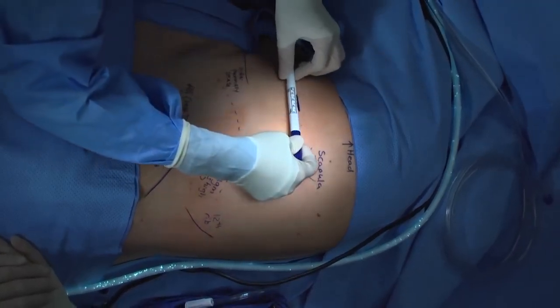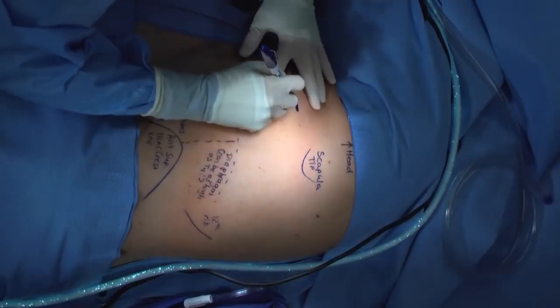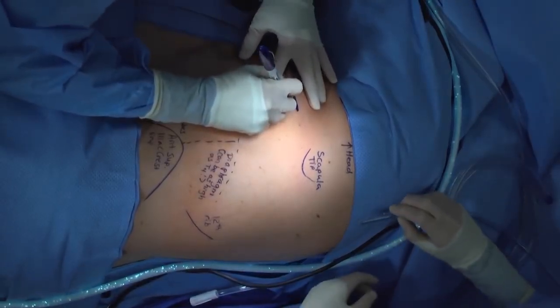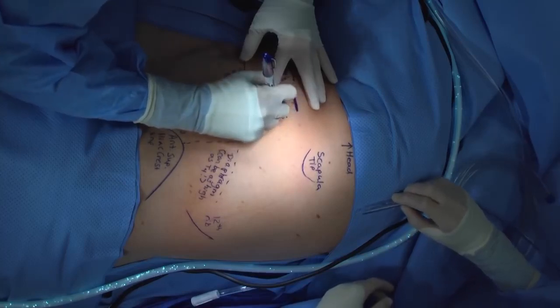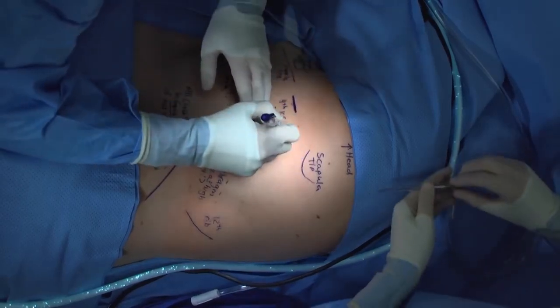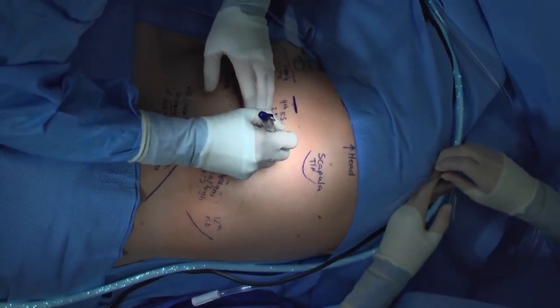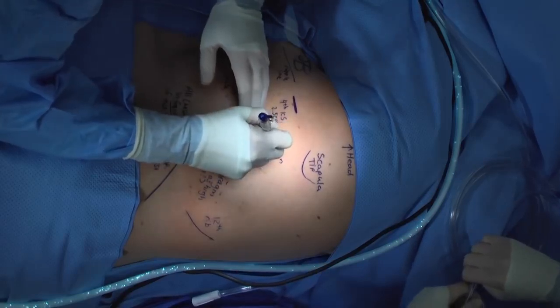When draping, always make sure to keep your landmarks in view so that you can plan your incision or change accordingly. Always make sure that you have an adequately sized incision. Here you can see that we are planning an incision that has adequate room for us to introduce both our finger and the chest tube to allow us to help direct the tube and ensure accurate placement.